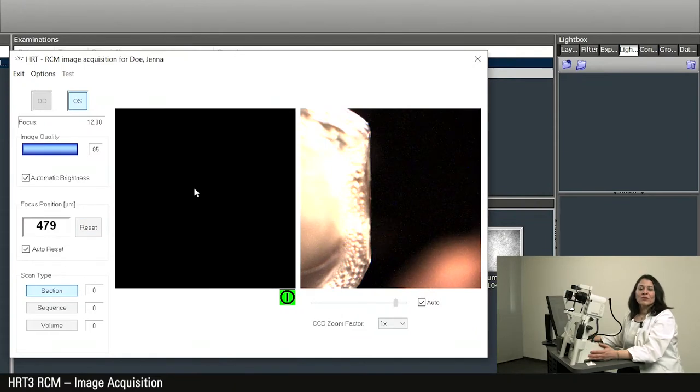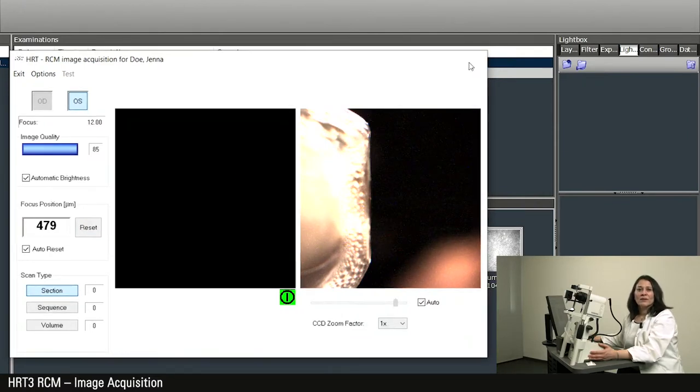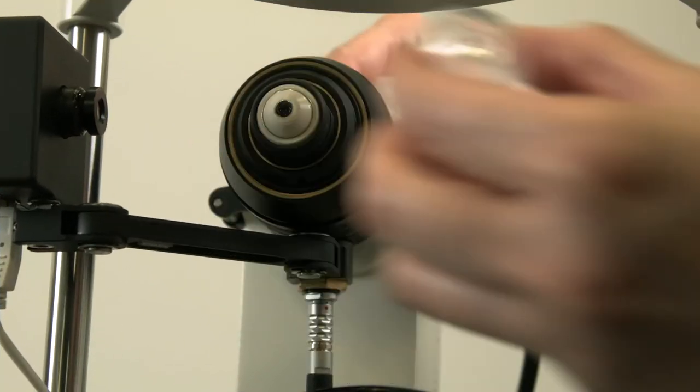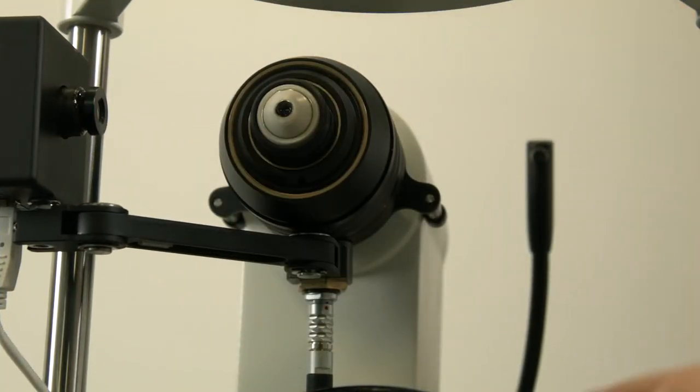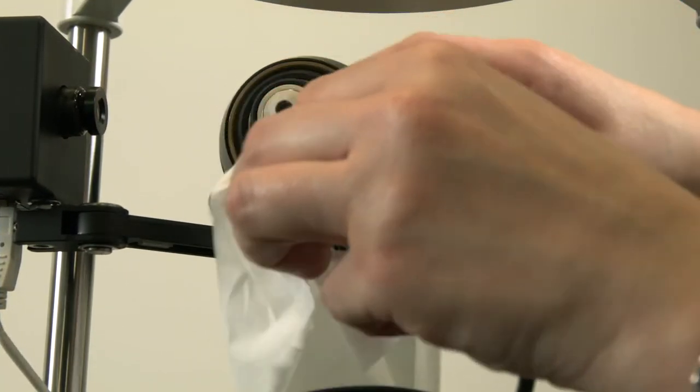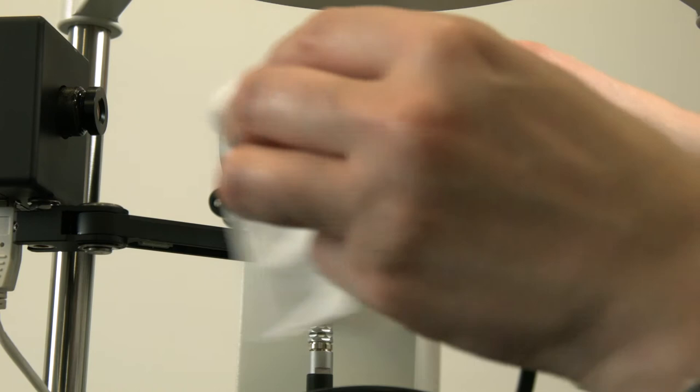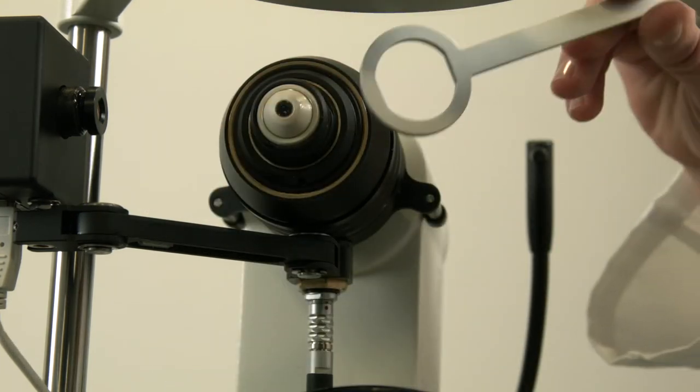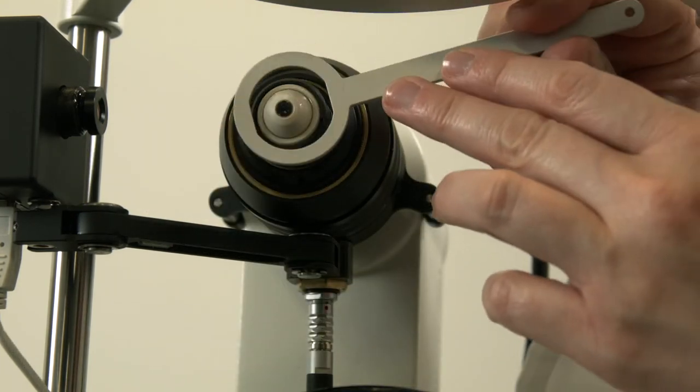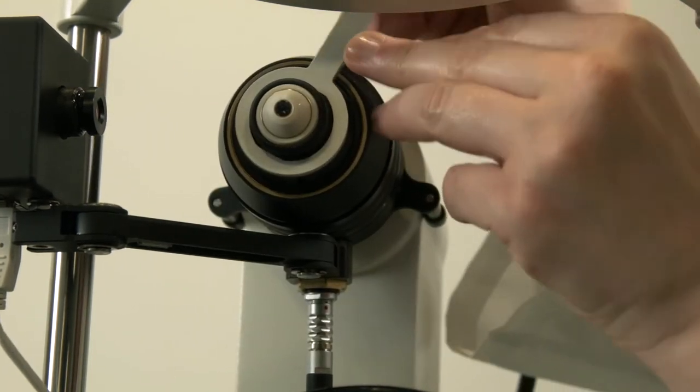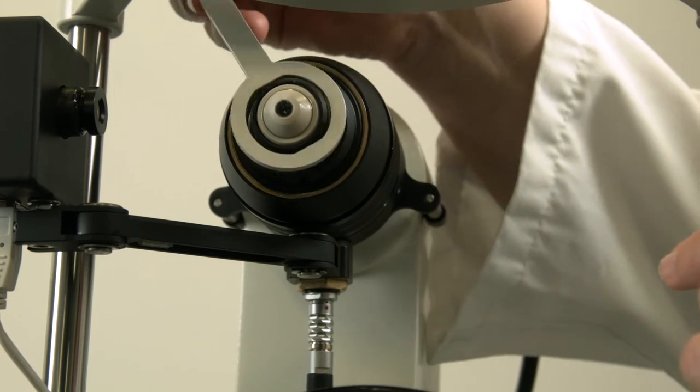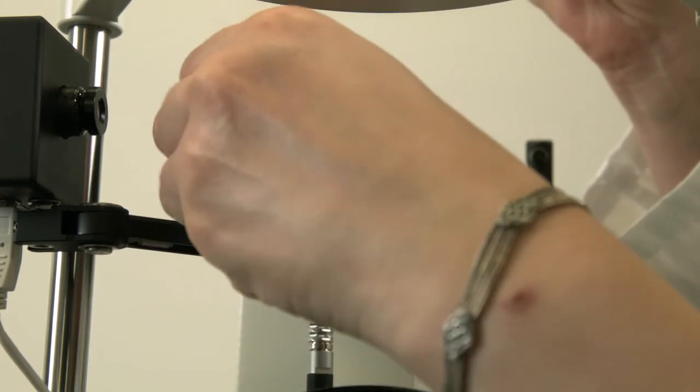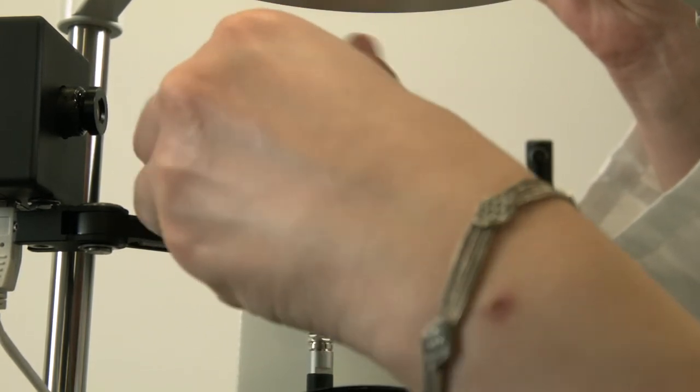After the measurement, close the acquisition window via exit, dispose the tomo cap, and clean the front surface of the objective with the cotton swab moistened with distilled water. In addition, after removing the tomo cap, you can unscrew the tomo cap holder with this tool which is included in the accessories. This can be cleaned with liquid detergent.